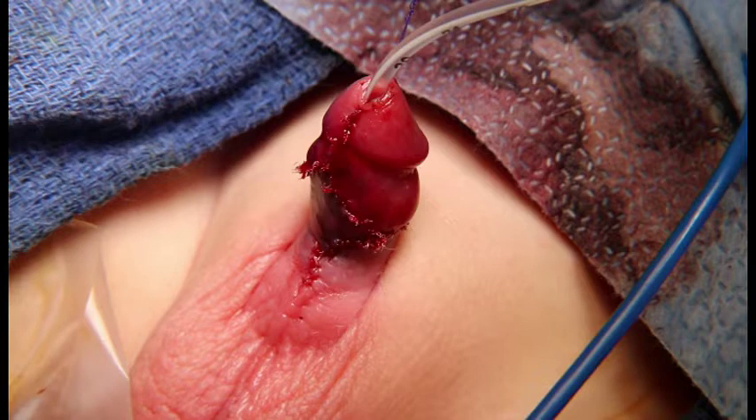The stent is fixed to the glans and a double-faced dressing is placed. Patients typically have the stent and dressing in place for a week and are managed with a double diaper technique.